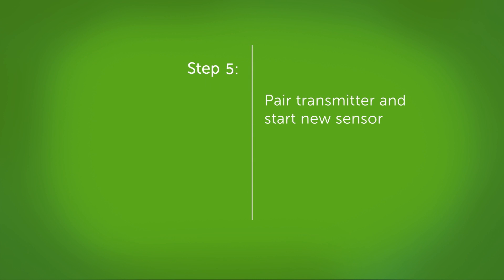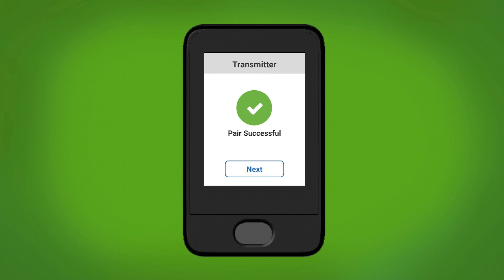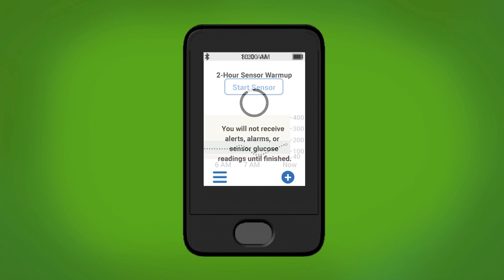Now it is time to pair your new transmitter and start your new sensor. Wait for your transmitter to pair and tap next on the pair successful screen. Tap the start sensor button. Now your two-hour sensor warm-up has begun. In two hours, you will start receiving your alarms and readings again.